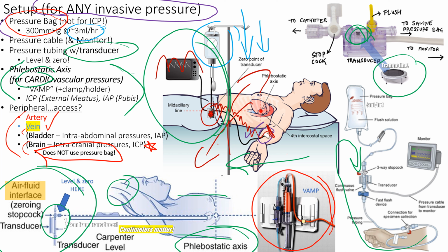Okay, yes? Bottom left right here. Are we leveling to the stopcock? It's a good point. We have a slide on leveling, but it needs to be leveled at the air-fluid interface.